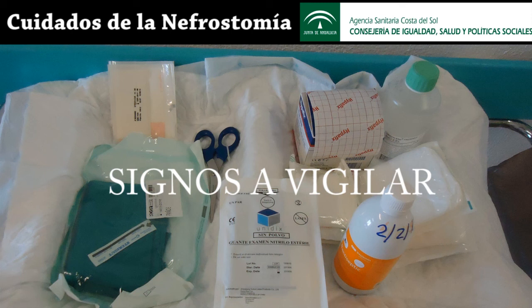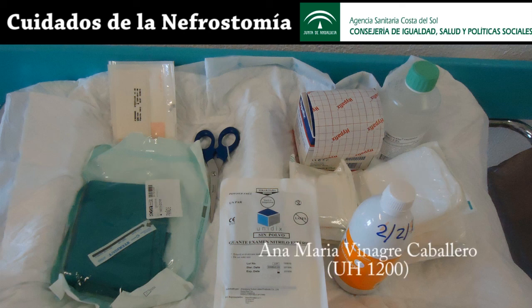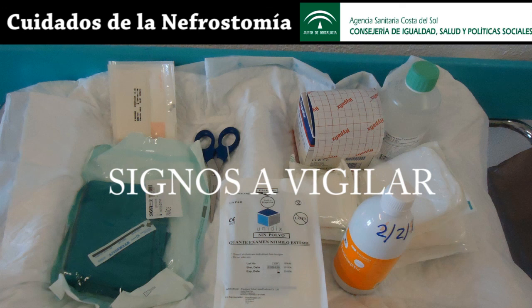Signs to be alert for. Contact your doctor or nurse immediately if there is blood in your urine, if the catheter accidentally comes out, if you have a fever and severe costal pain, if the area around the tube becomes uncomfortable, looks red or swollen or feels warm, if your urine contains little crystals or stones, if your urine is abnormally foul smelling, and if any changes in the amount of urine occur. It is important to remember that we must closely control the amount of liquids being drunk and eliminated. Large amounts of fluid can be lost through sweating in hot weather conditions or warm climates.